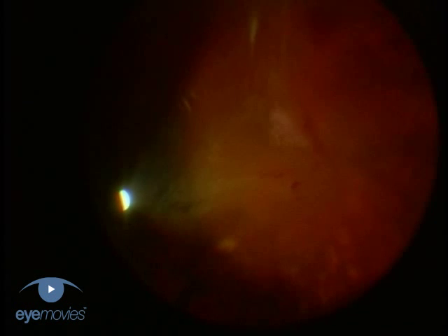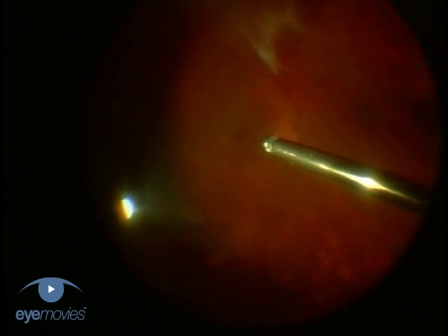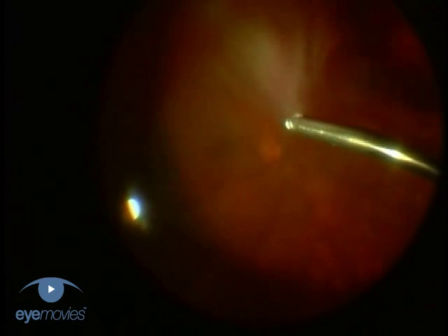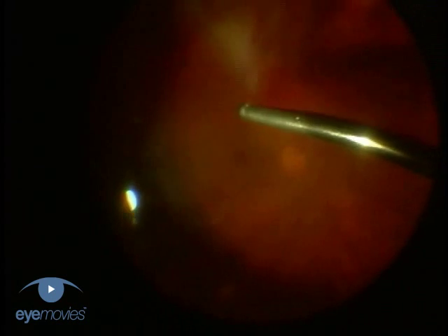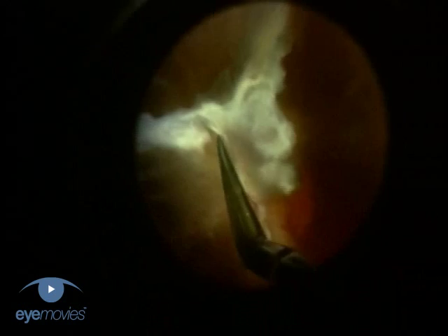Vitreo-retinal surgery in eyes with advanced diabetic eye disease encompasses a spectrum of complexity, from relatively simple vitrectomy in eyes with vitreous haemorrhage and vitreous detachment, to exceedingly complex surgery in eyes with tractional retinal detachment and extensive vitreo-retinal adhesions.